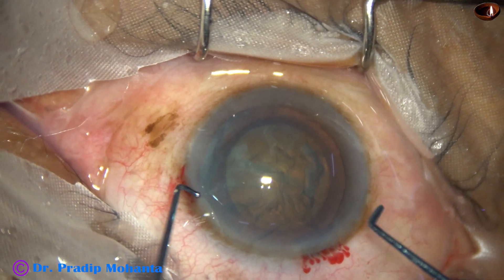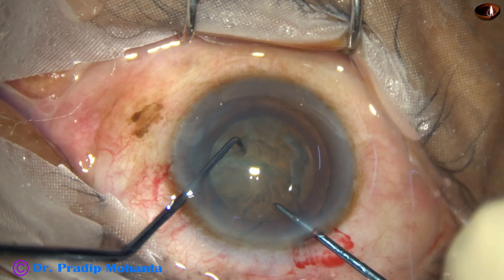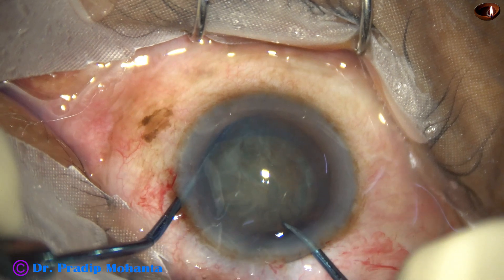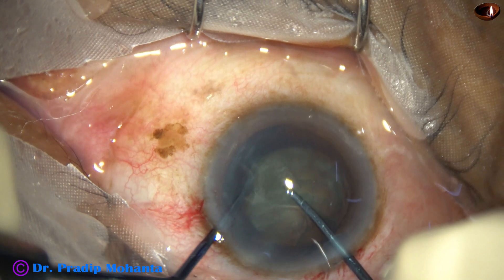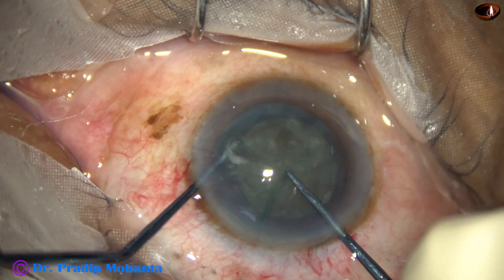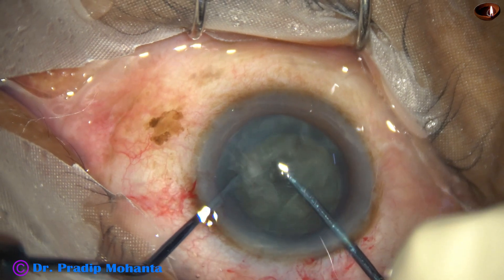The sustainer goes in first, then the pre-chopper. The pre-chopper engages just in front of the anterior capsular rim, in front of the main wound. The sustainer then hooks the opposite equator. The two instruments come to each other and lateral separation is done. Now the nucleus is rotated and one hemi nucleus is chopped like this.